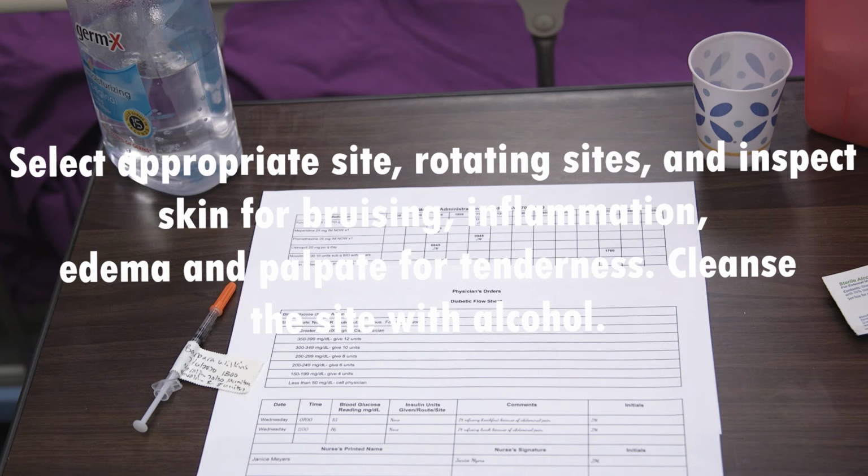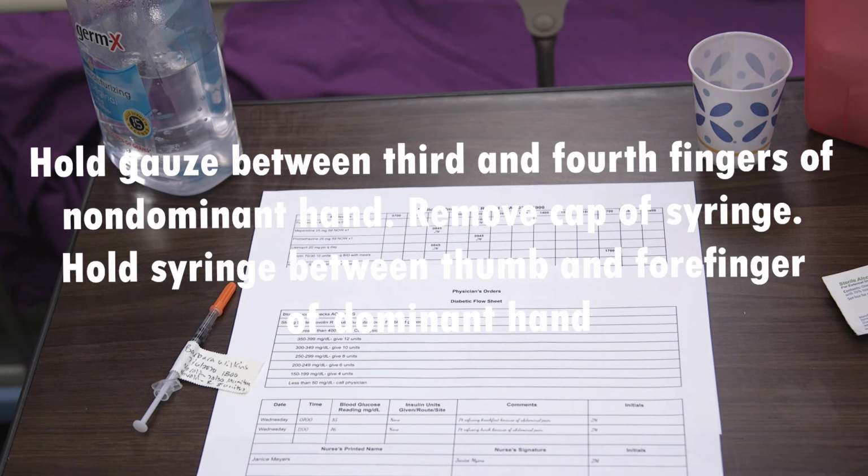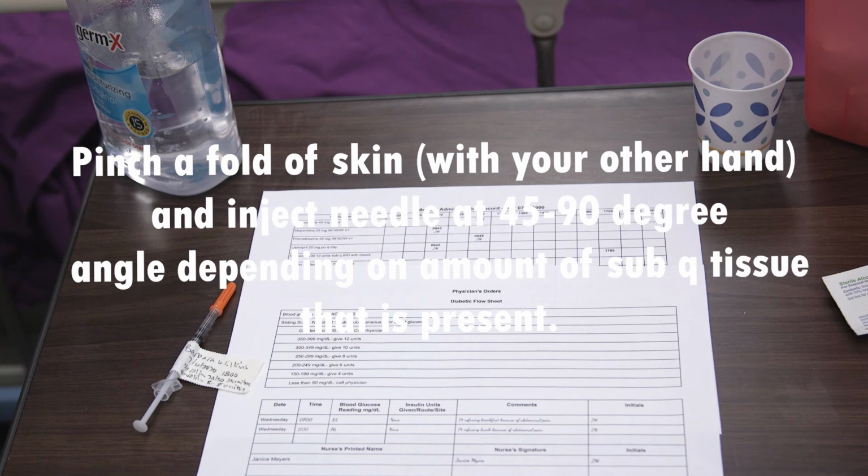Select appropriate site, rotating sites, and inspect skin for bruising, inflammation, edema, and palpate for tenderness. Cleanse the site with alcohol. Hold gauze between third and fourth fingers of nondominant hand. Remove cap of syringe. Hold syringe between thumb and forefinger of dominant hand. Pinch a fold of skin with your other hand and inject needle at 45 to 90 degree angle depending on amount of sub-Q tissue that is present.